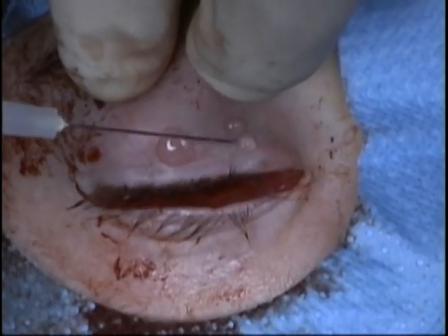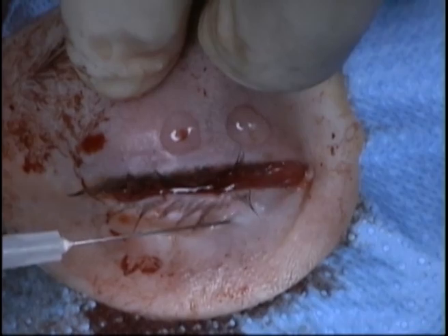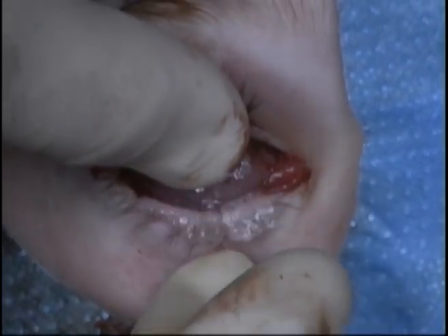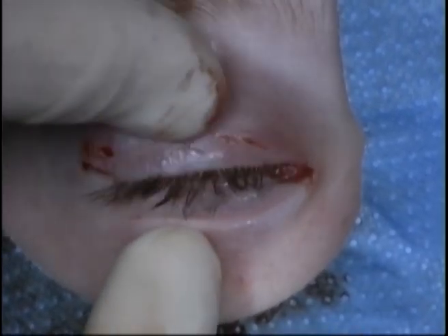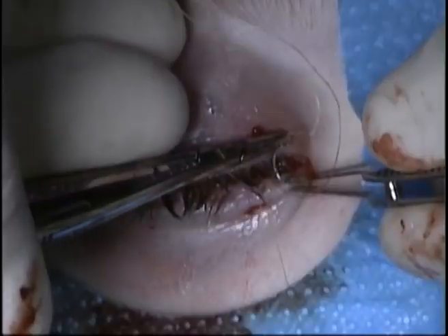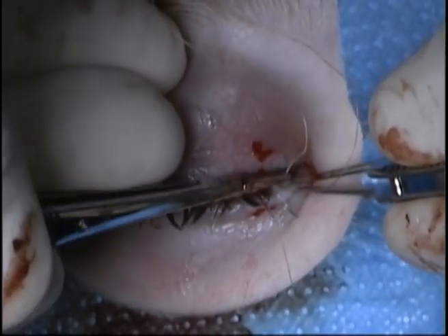A conformer is then placed. Due to the fact that there will be a lot of inflammation after this surgery, a temporary suture tarsorrhaphy is placed. This is performed with 5-0 chromic suture. These sutures will usually dissolve by about three weeks.